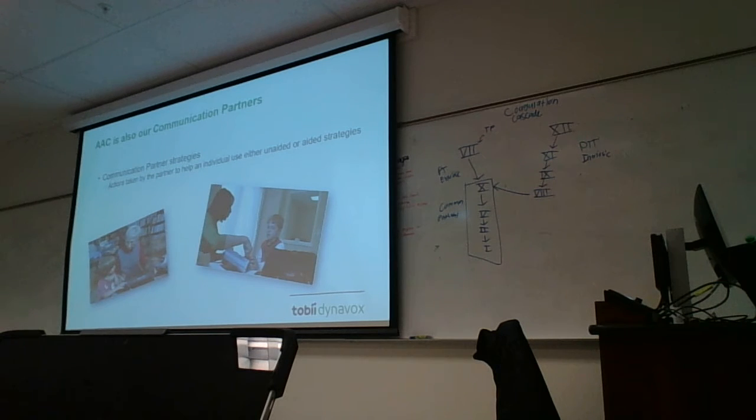So a lot of times, especially with our device users, we kind of hover over their shoulder or maybe get in their way. This is to be able to see what they're trying to type while maintaining eye contact. And that feature could be turned on and off. Sometimes clients don't want to share what they're about to say, so they do have that option.